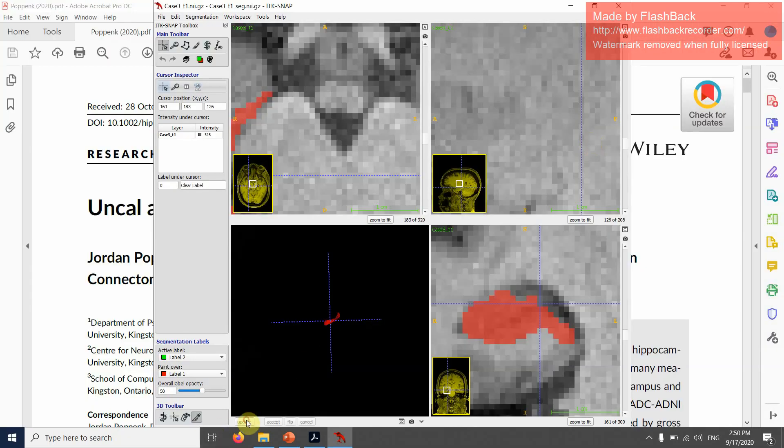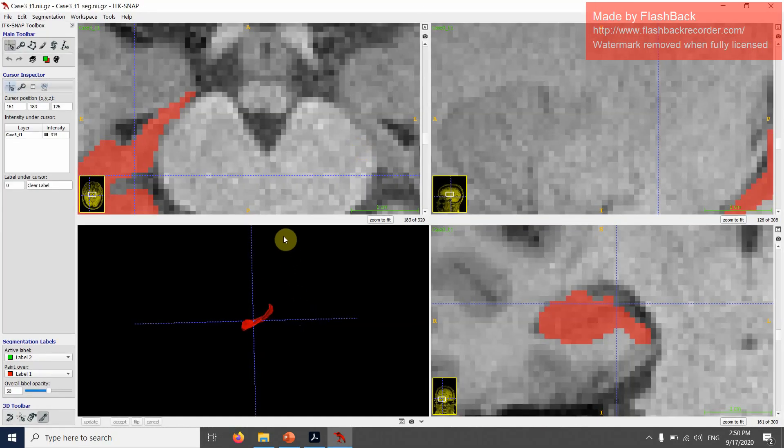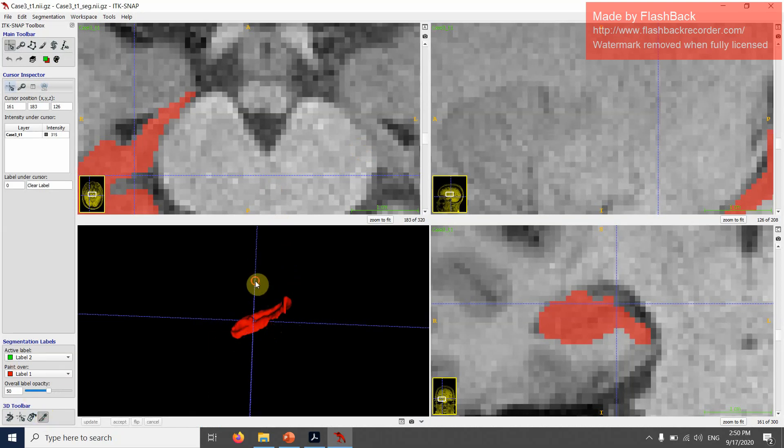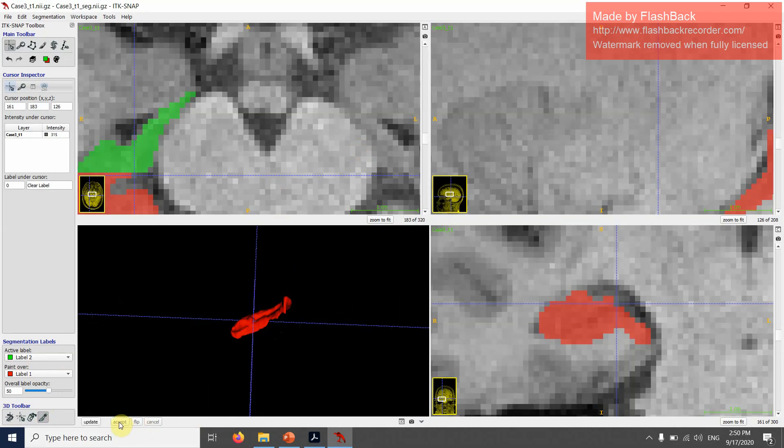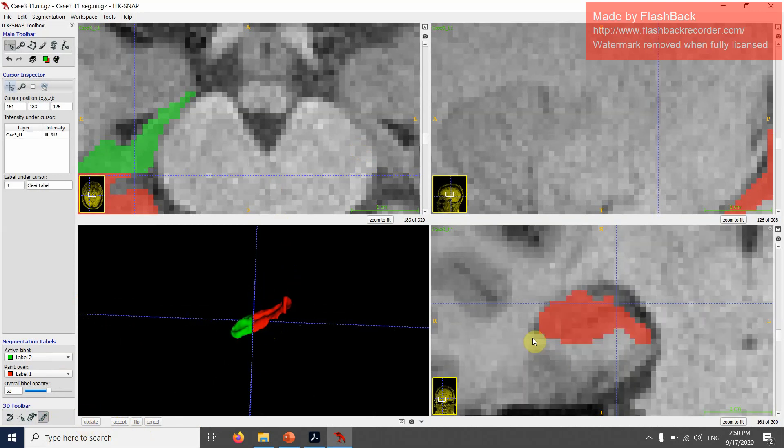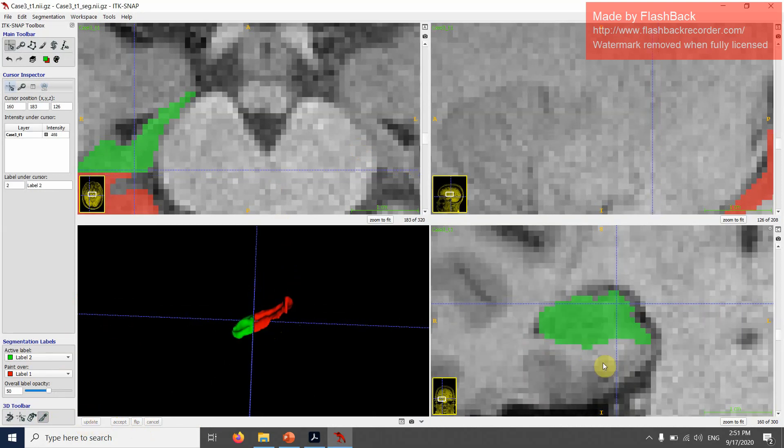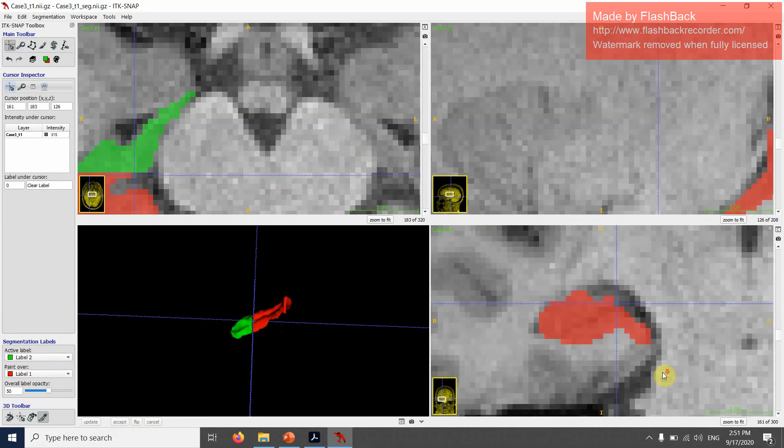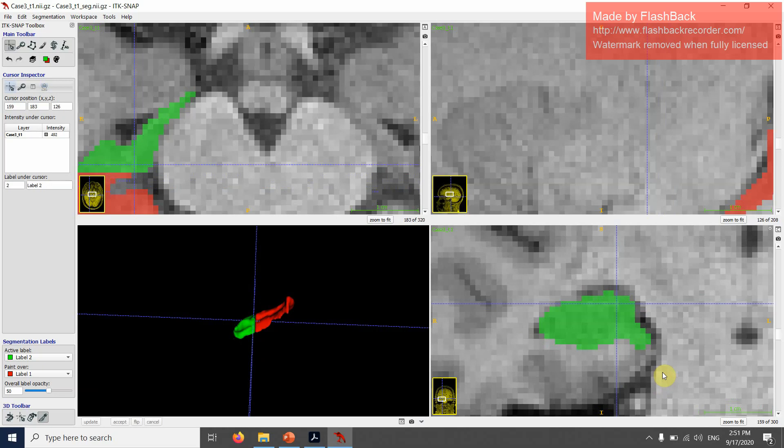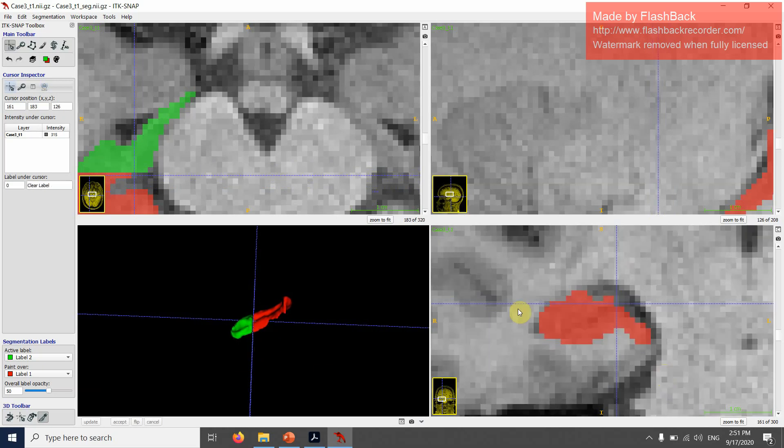We'll do the same thing in 3D. I have now green as anterior label and red as posterior label.